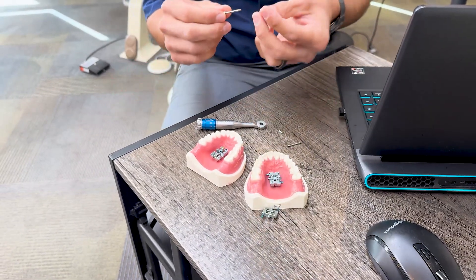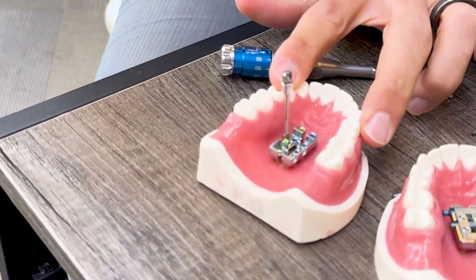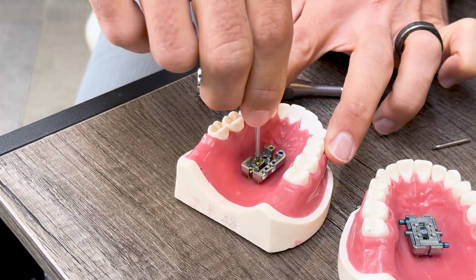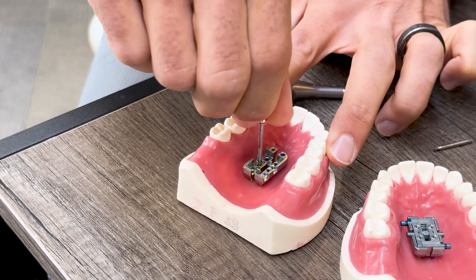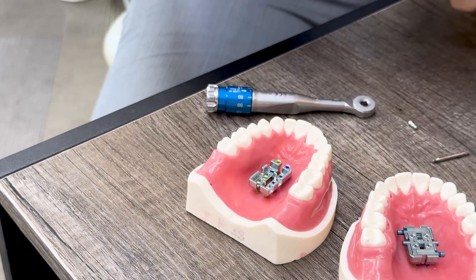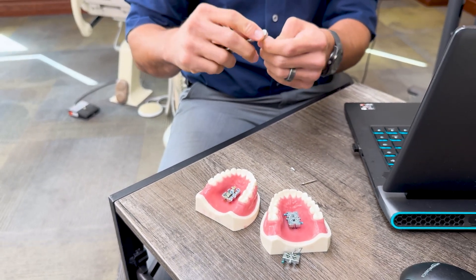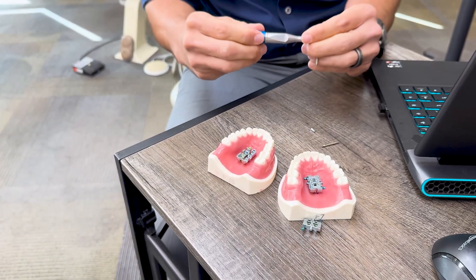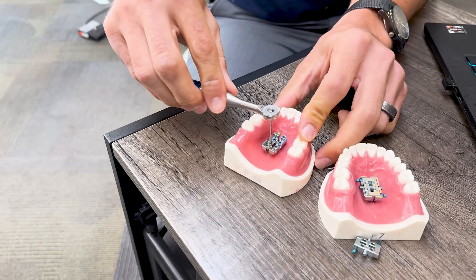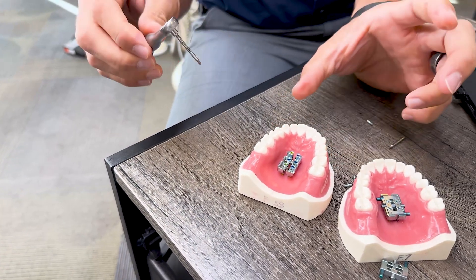Now you're not having to swap drivers mid-procedure. As you're placing it, it's already been piloted so the orientation is as ideal as possible. It's going to thread through until you hit that anchor body, and then those threads engage and it continues to thread all the way down — and then it locks. You cannot overturn it. A torque wrench is needed because if you put 100 or 200 newton-centimeters of force on it you could strip something, but cranking it down to the specified 35 newton-centimeters — that torque wrench comes from Facegenics — when you get to the appropriate torque it clicks, so you know it's fully secured, not over-torqued, not under-torqued.